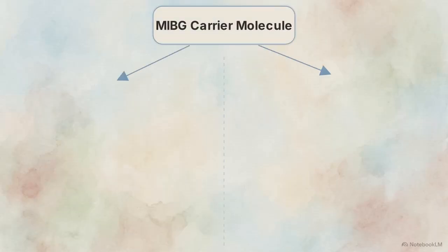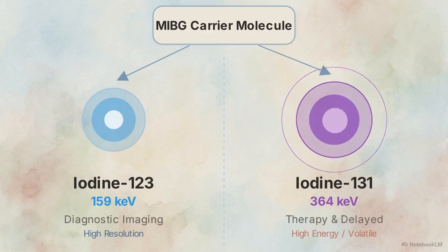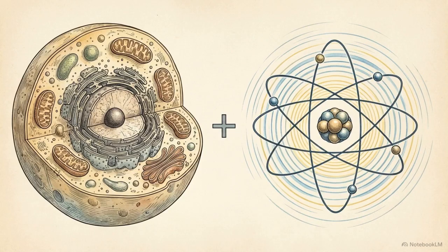physical properties of the specific isotope attached to the MIBG, either iodine-123 or iodine-131. Iodine-123 emits a 159 kiloelectron-volt photon. This yields a higher count, cleaner cardiac image, and normal faint adrenal uptake. Iodine-131 requires delayed imaging times. It is heavily utilized to estimate target-to-background noise when planning targeted MIBG therapy. Identifying a tracer requires evaluating both its biological destination and the specific physical energy of the isotope.